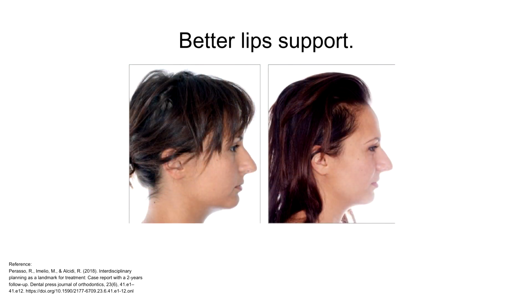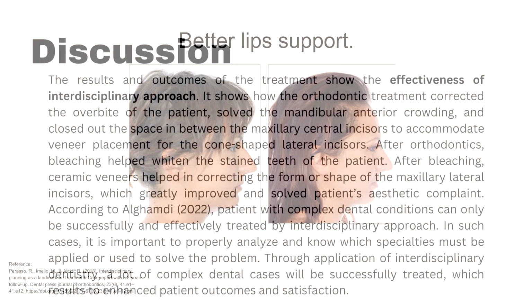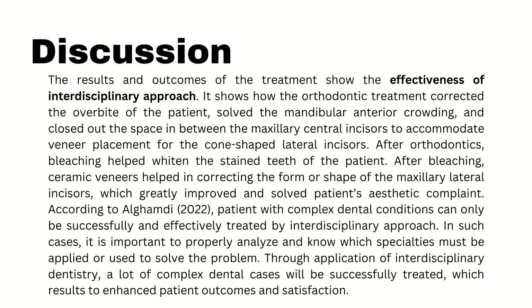And lastly, the significant reduction of inclination and overbite has led to better lip support with no loss of vertical dimension. The results and outcomes of the treatment show the effectiveness of the interdisciplinary approach. It shows how the orthodontic treatment corrected the overbite of the patient, solved the mandibular anterior crowding, and closed the space between the maxillary central incisors to accommodate veneer placement for the cone-shaped lateral incisors.